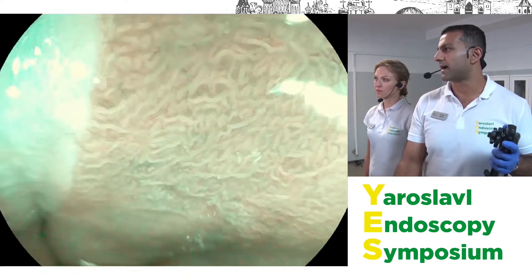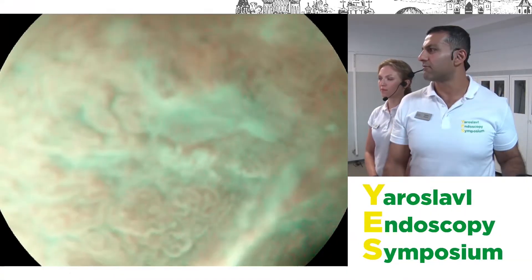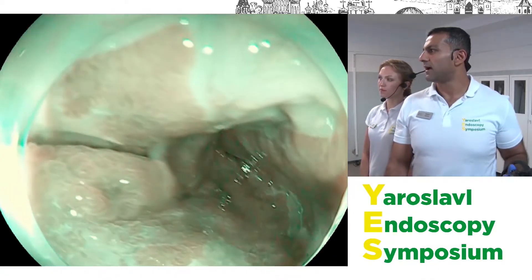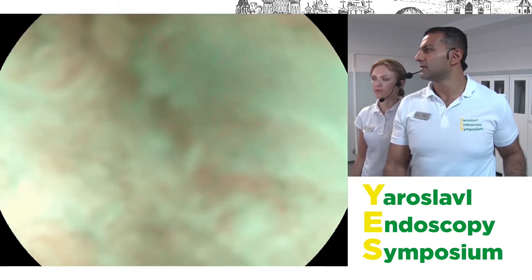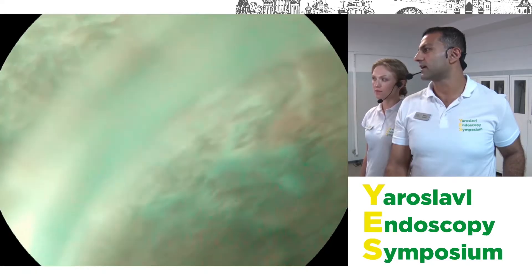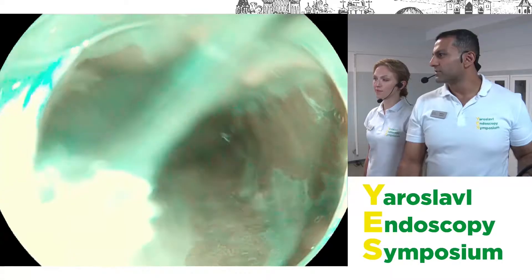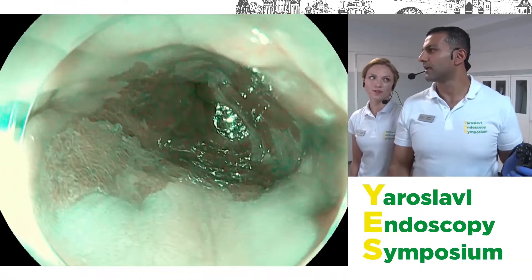This is all very normal metaplastic Barrett's. What you want to look for is any area that doesn't fit that pattern — anything slightly irregular in terms of the mucosal pattern. There is a small area that caught our eye when we were off-camera that we're going to look at, but actually this is probably just a small squamous regenerative area from a previous biopsy site. With the magnification scope you can see what fantastic resolution we get of the individual crypts, down to almost a cellular level.